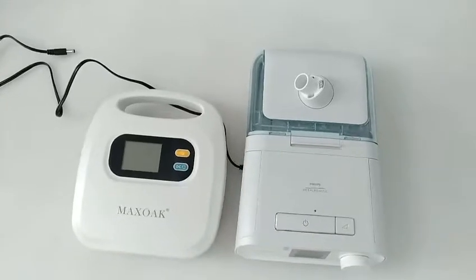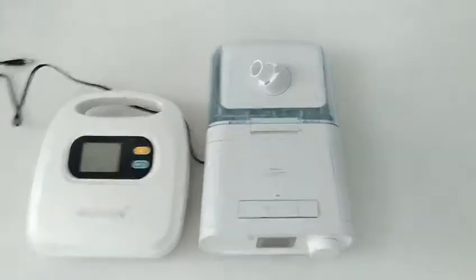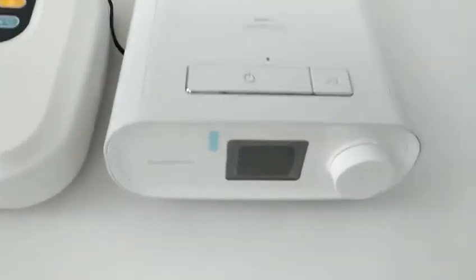Connect the CPAP to the right output port of K5. For the Philips DreamStation, its required DC voltage is 12 volts.